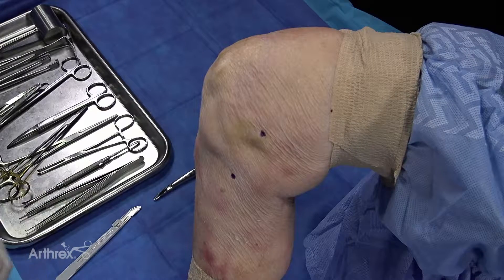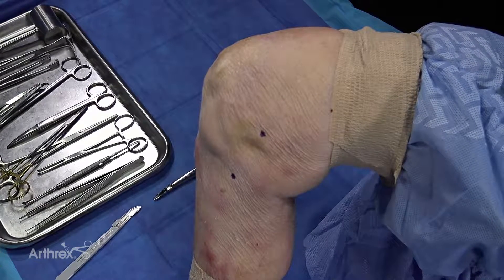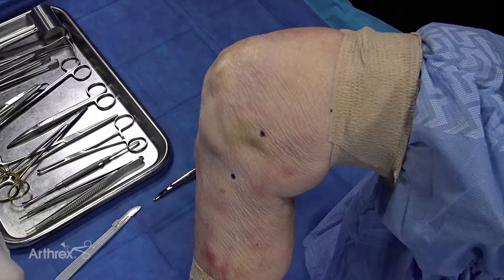This supplements a lot of times my BTBs and my ACLs that I do, because these young people have a concomitant medial collateral ligament injury, which you don't need to open. You can just do an internal brace over the top.